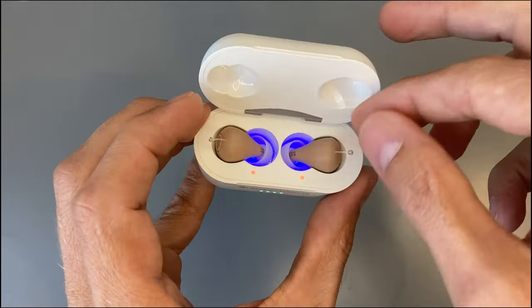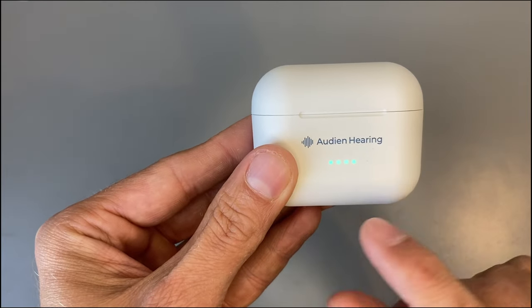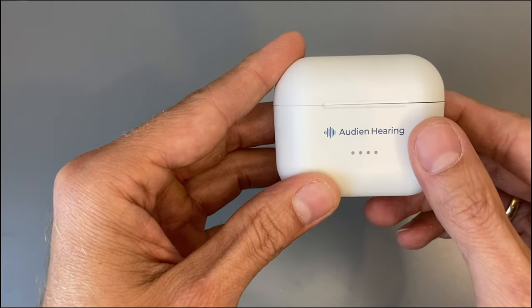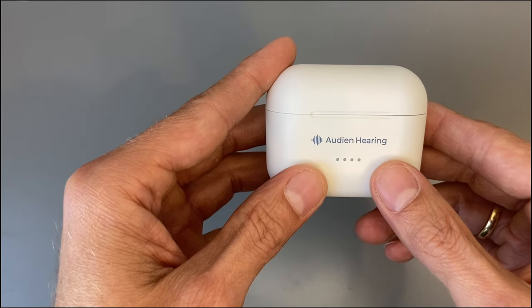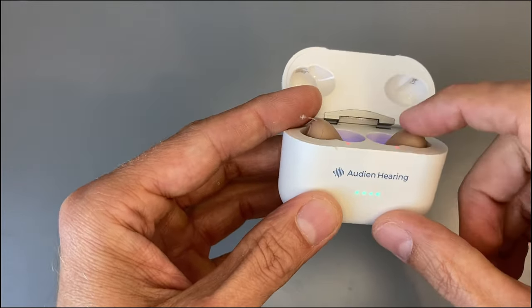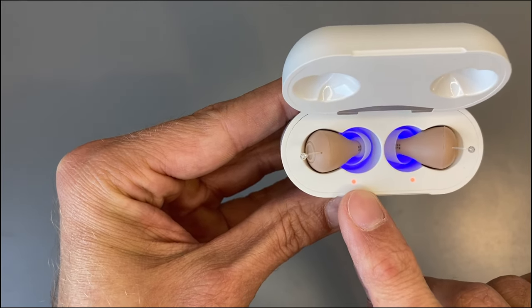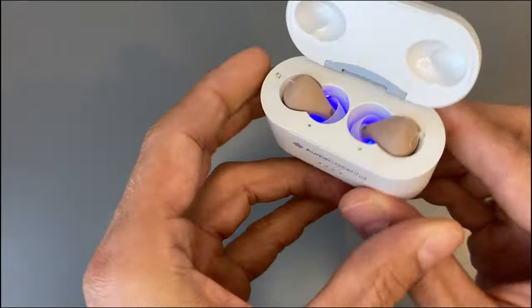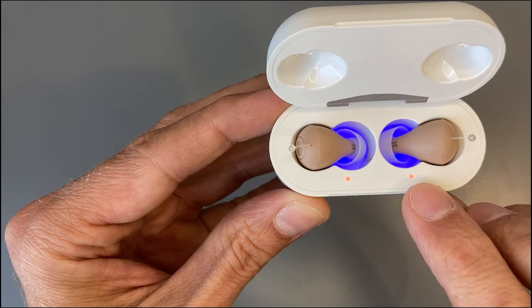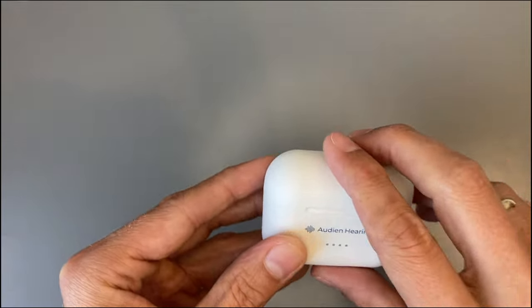The charger has two kinds of indicator lights. The outer lights show the charging status of the charger itself — the charger has a built-in power bank with enough power for up to three extra charges. When all four lights are green, the charger is completely charged. The inner lights show the charging status of the hearing aids. If you press the button on the charger, the lights show you the current charging status.